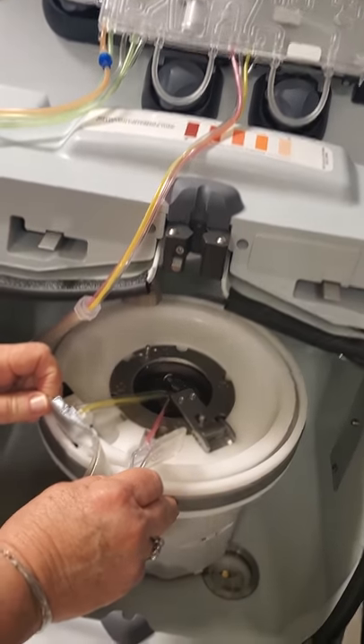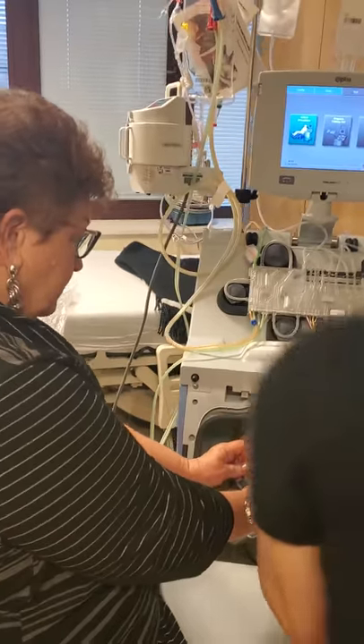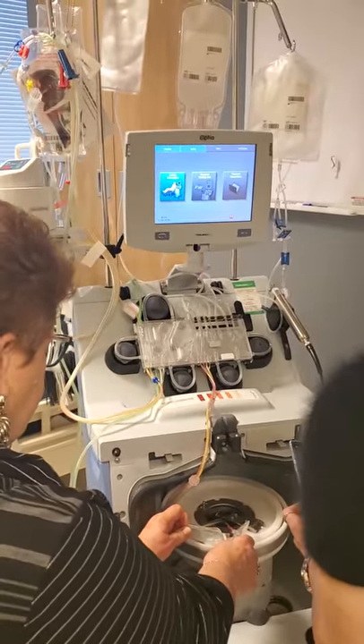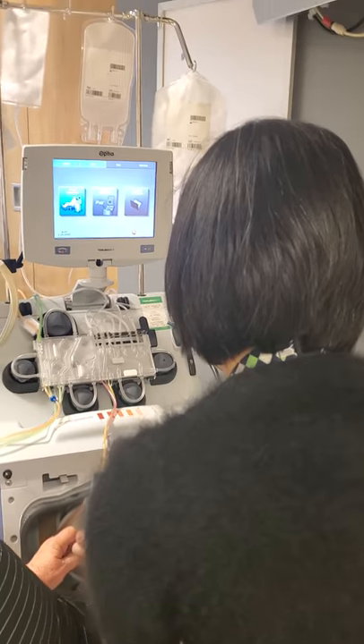Can you hold that for me? I'm putting images on the SOP. Go way down, go way in.